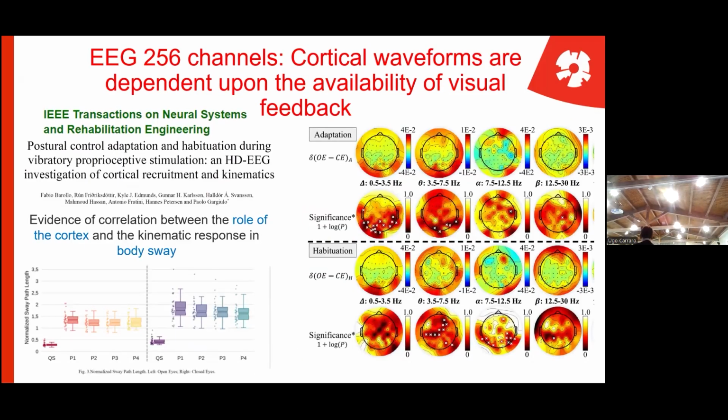To make the story short, what we found out is that reading the EEG signal is the real challenge, okay? And I'm always using the same example. Reading an EEG signal is like trying to hear what is happening in the next room. In the next room, we have more chance to understand what is happening if we know the story.